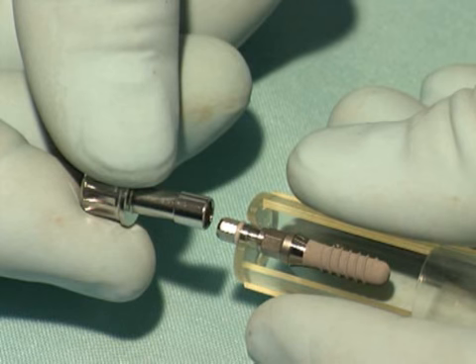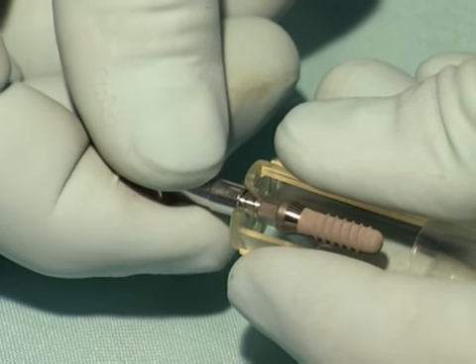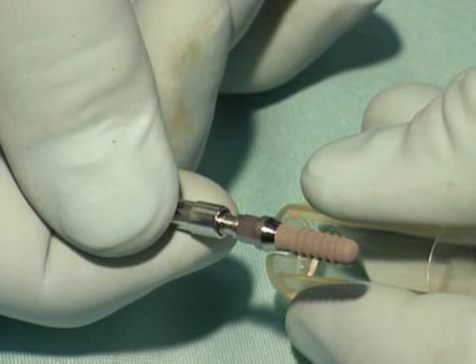To remove the implant from its holder, the adapter for ratchet is connected to the transfer part and must audibly click into place. The ampoule is then pulled downwards with slight twisting movements and the implant is lifted out. While doing so, your hand should be supported on a firm surface.